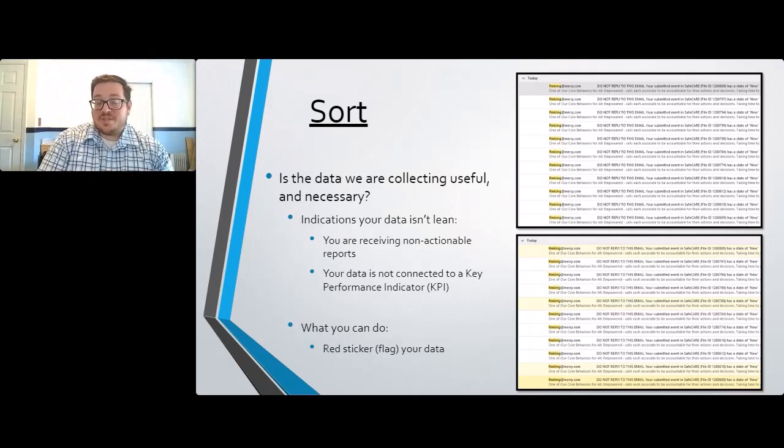Okay, that's a good goal, that's a good vision, but it's not a KPI. A KPI would be, we want to reduce the amount of wet trays by 30%, or we want to reduce the number of dirty lumens coming to the clean side to 0. Those are key performance indicators. It's something that you know where the floor is, you know where the ceiling is, and you know where you stand.